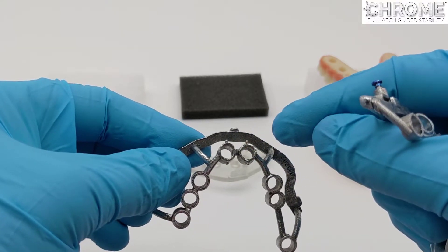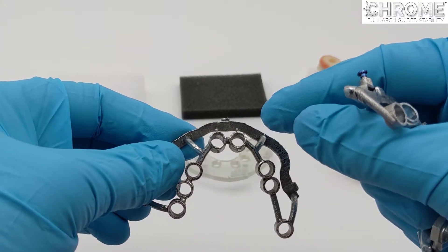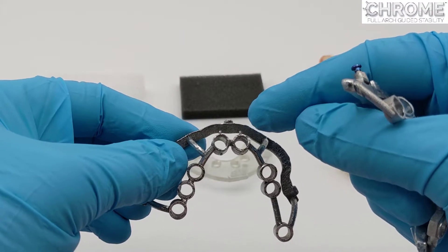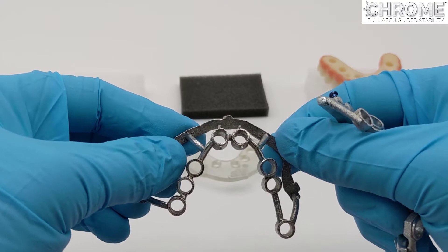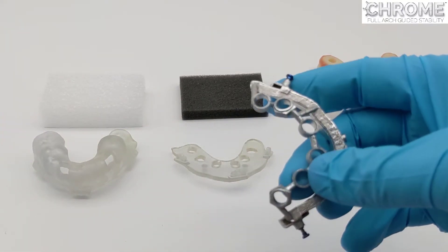The osteotomy guide comes in different configurations, sometimes based on the software and sometimes based on the guided kit. This is always advancing and changing, and it will always indicate how to stop rotating the implant.